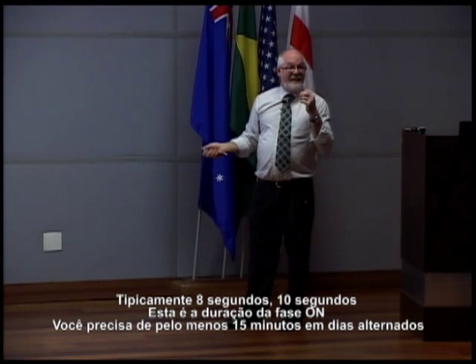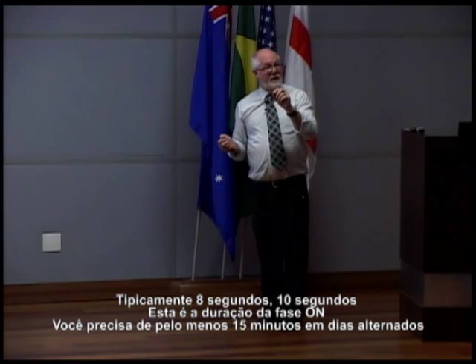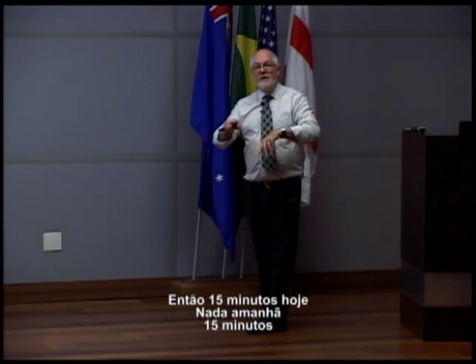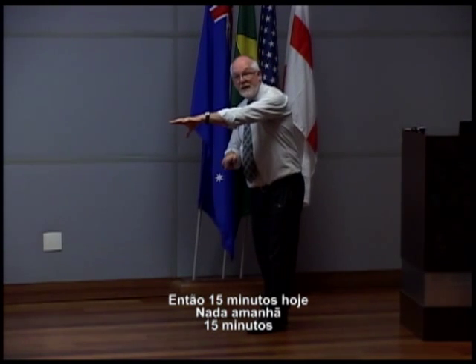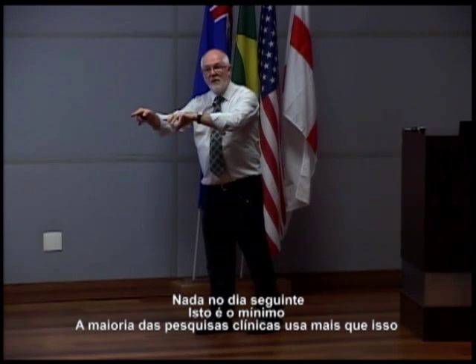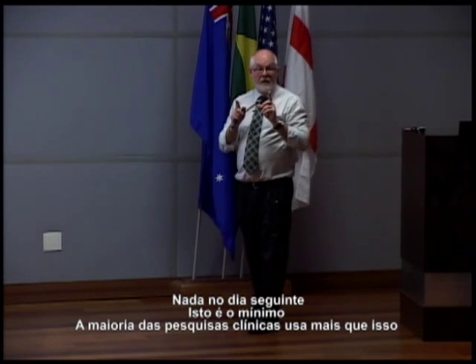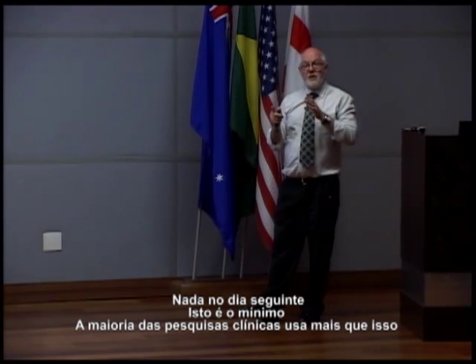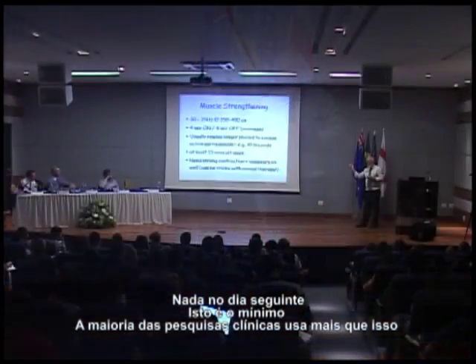You need at least 15 minutes on alternate days. So 15 minutes today, nothing tomorrow, 15 minutes, nothing the next day. That's your minimum. Most of the effective clinical research papers use more than that.